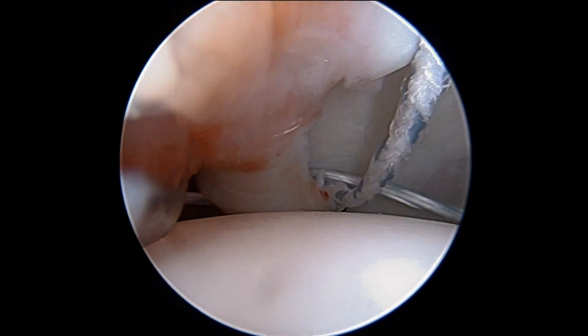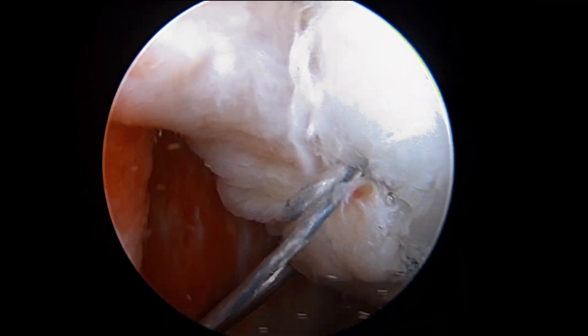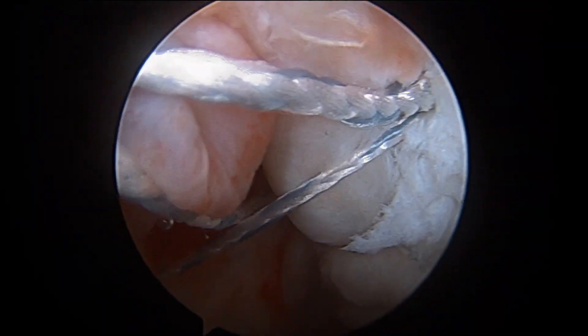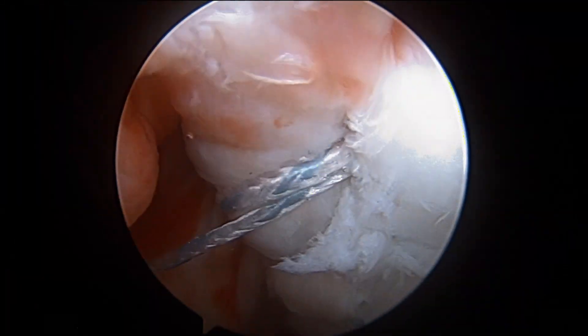Typically we'll place about three or four anchors, starting at six o'clock on the clock face and then working our way anteriorly and superiorly to seven, eight, and nine o'clock.